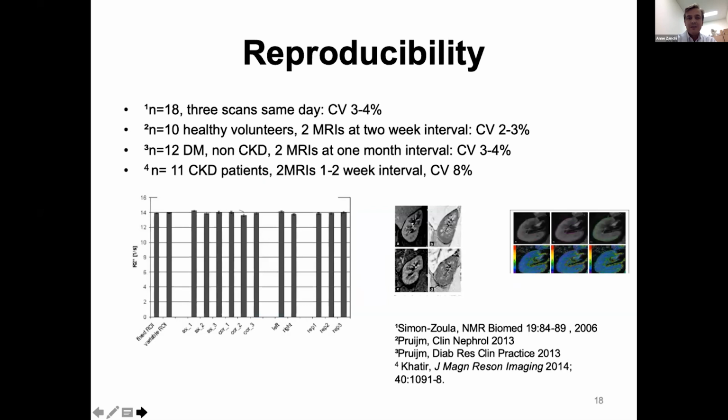The method has also a good reproducibility. Here a few small studies showing MRIs performed in the same subjects, either several times on the same day or on different days, with acceptable coefficients of variation of this technique. Next slide.